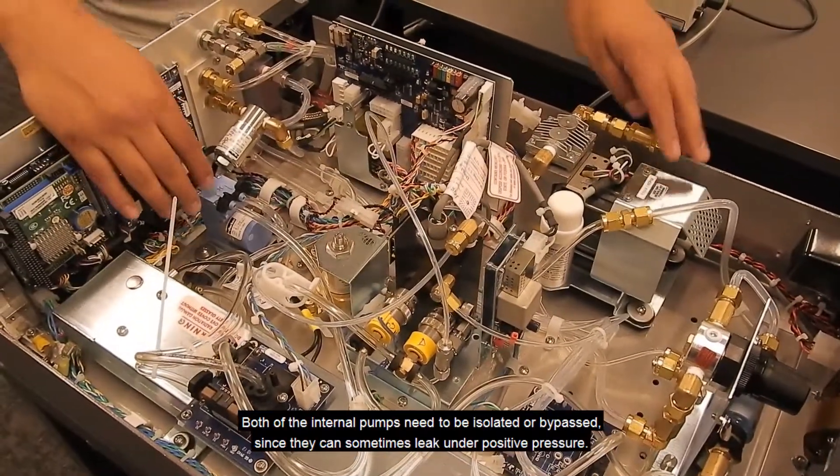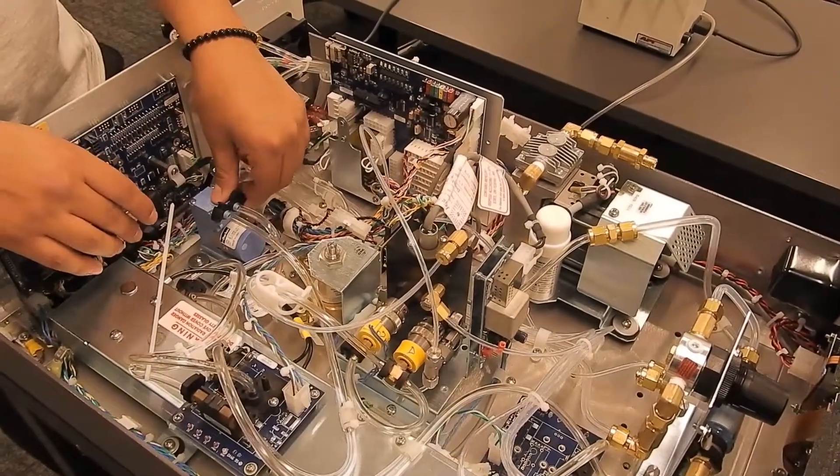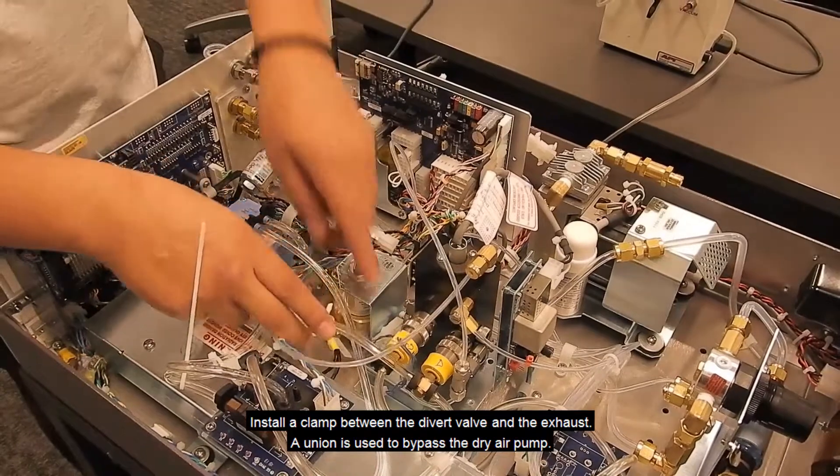Both of the internal pumps need to be isolated or bypassed since they can sometimes leak under positive pressure. Install a clamp between the divert valve and the exhaust.